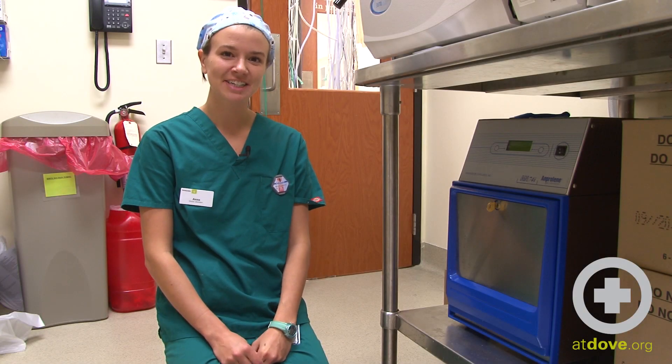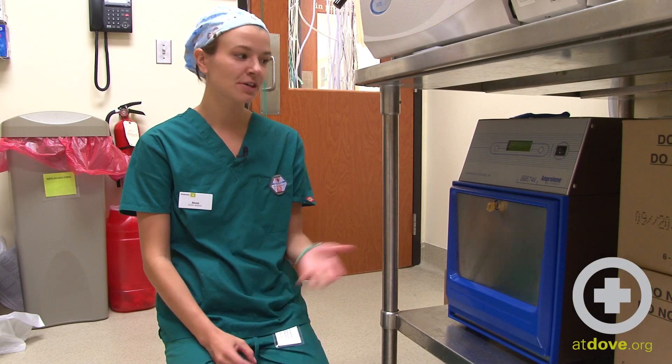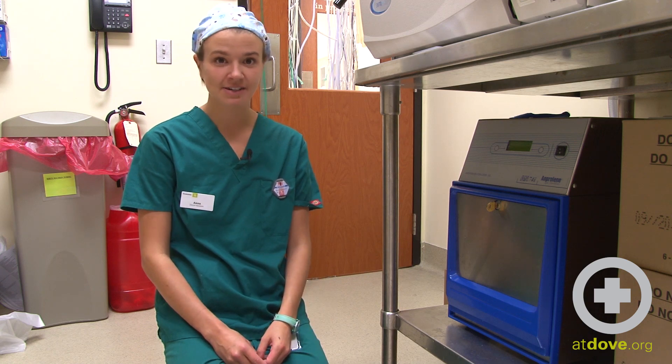Hi, my name is Anna. I'm a surgery assistant here at Dove-Lewis, and today we're going to be loading and operating our gas sterilizer.